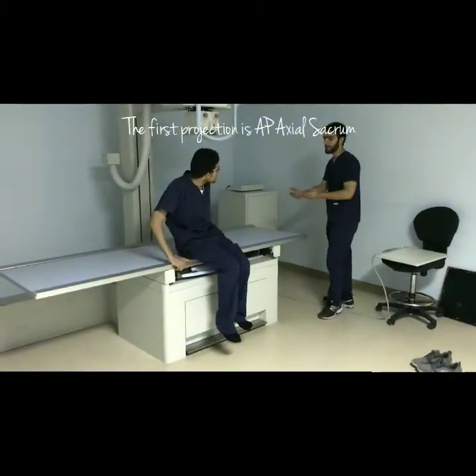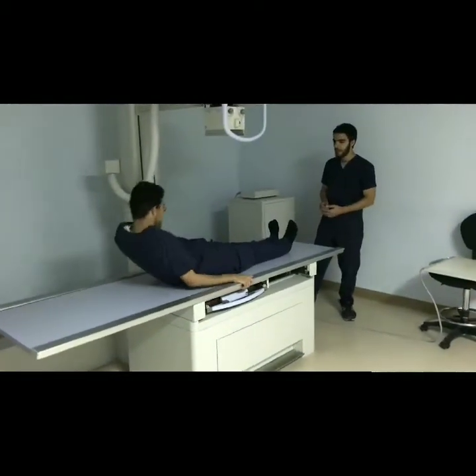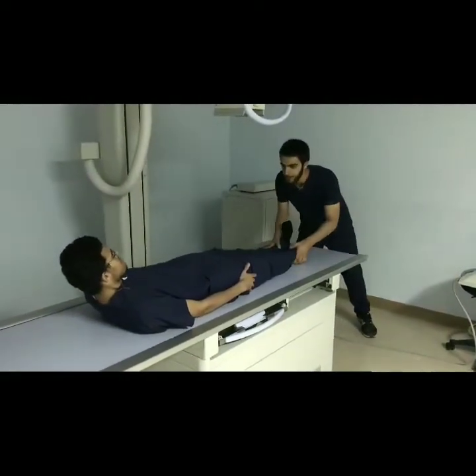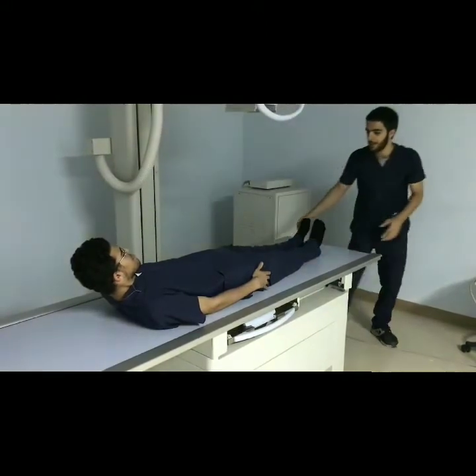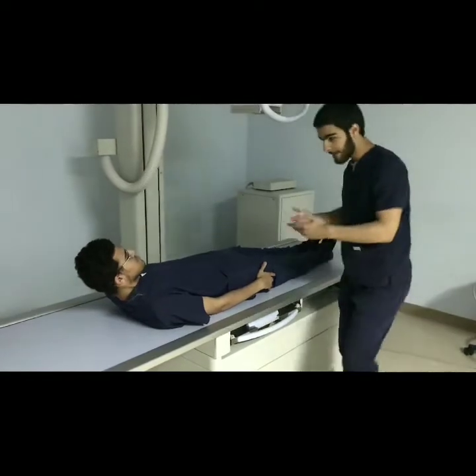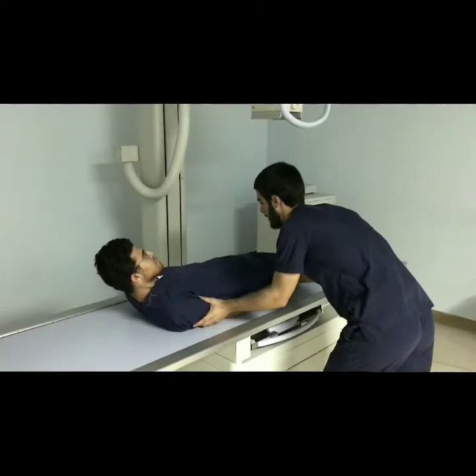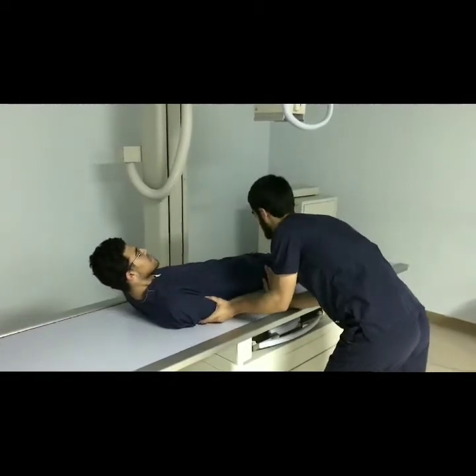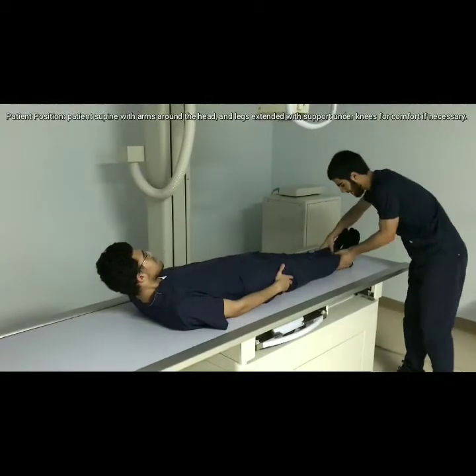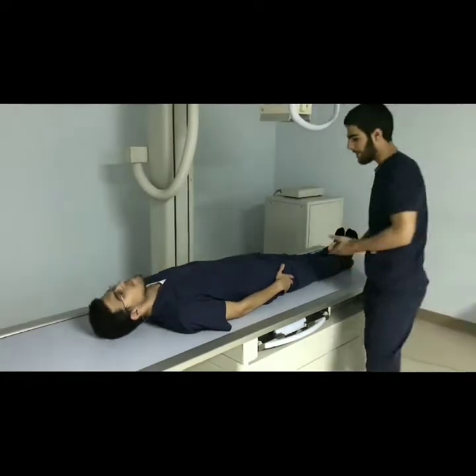Tell the patient to lie down at the middle of the table to avoid inconvenient and constant movements. Take consent and alert the patient that you will attempt to align him with the middle of the table and the image receptor. Push him to the middle of the table until precision is achieved. Maintaining communication with the patient allows for effective positioning.